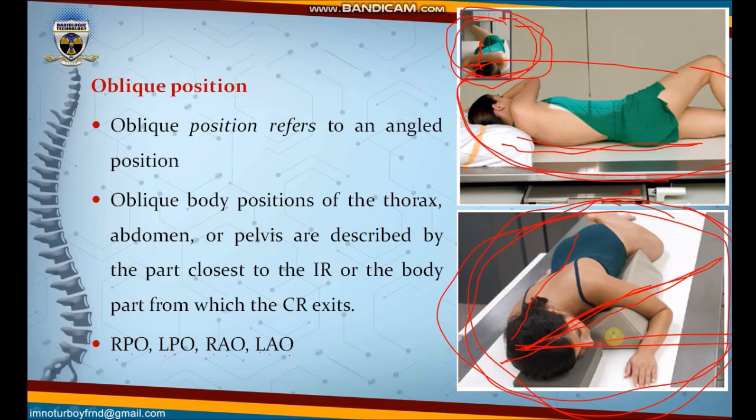In the next, again, face the bed. Try to lie down in a prone position. You are prone. Okay? And then, once you are prone, try to rotate your body towards the left side. That means you raise your right side of the body approximately 45 degrees.